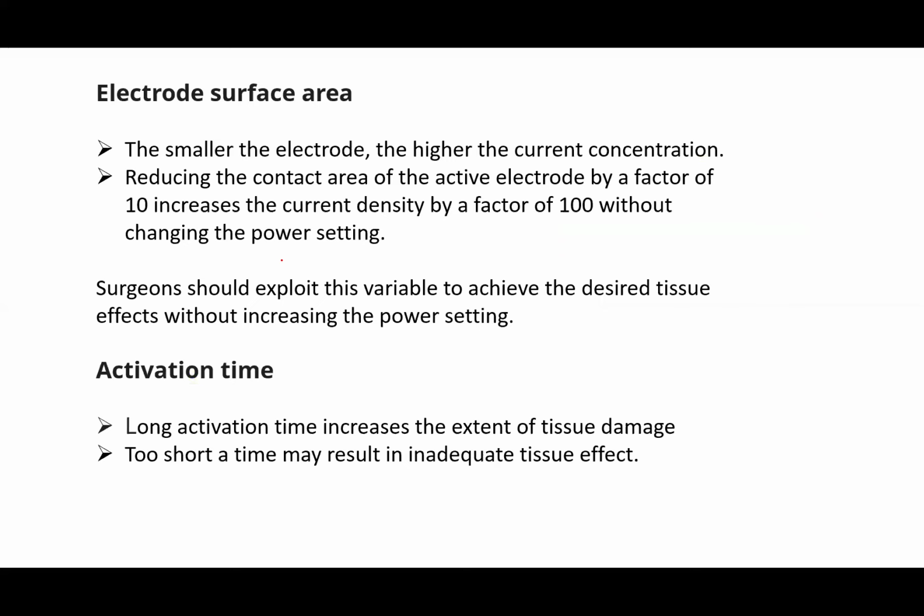Electrode surface area: the smaller the electrode, the higher the current concentration. All of this you are going to see in the slides when we share. Now, you should know that long activation time increases the extent of tissue damage.